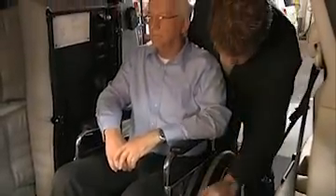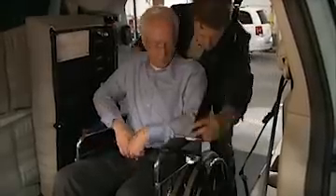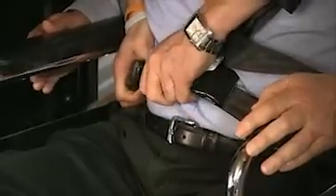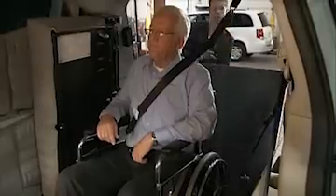locks the wheelchair brakes, and ties the chair to the floor. There are standard seat belts to fasten, and then it's time to sit back and enjoy the ride. Ensconced in the converted minivan, the limited mobility individual can now experience the freedom of the road.